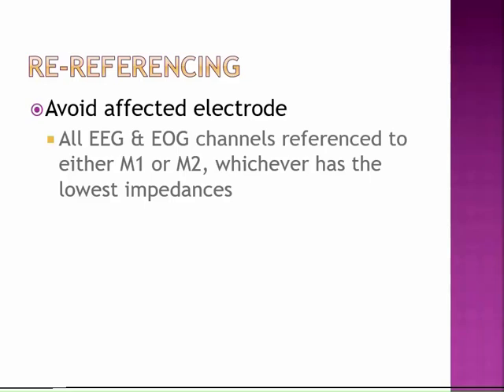You can certainly re-reference left leg 1 to one of your right legs to continue to get a channel until you're able to go in and fix it, instead of waking the patient up. So re-referencing will come back a few times for other types of troubleshooting.